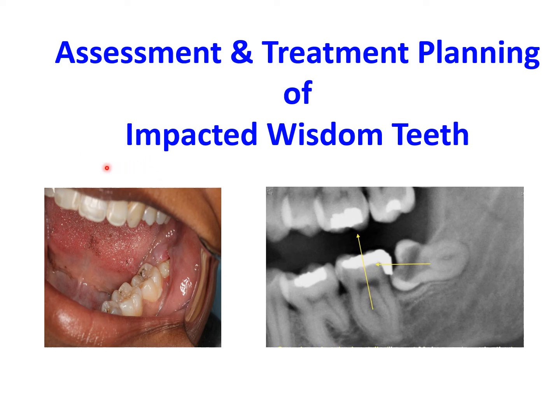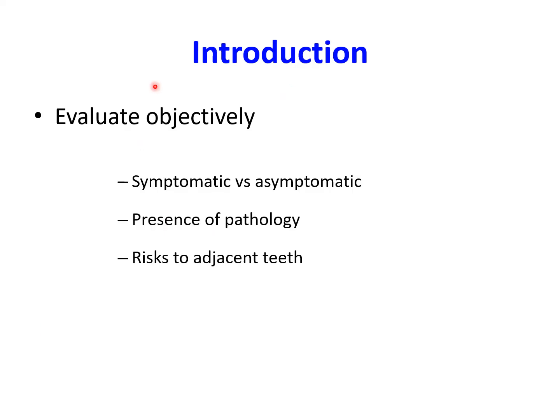Hello, in this presentation we shall discuss the assessment and treatment planning of impacted wisdom teeth, starting with clinical assessment, followed by assessment on radiographs and cone beam CT. Impacted wisdom teeth may have a wide range of clinical presentations. Therefore, it's important to evaluate each case objectively.